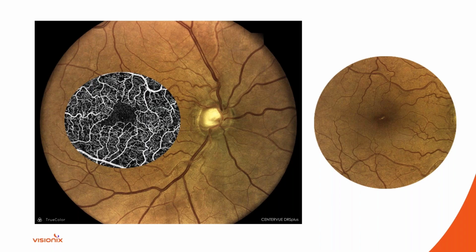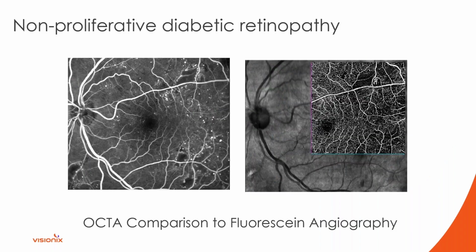Even though you're having trouble with your medication, your eyes look phenomenal. And guess what? They really, really don't. So this would be a beautiful way of explaining to the patient that something needs to be done.